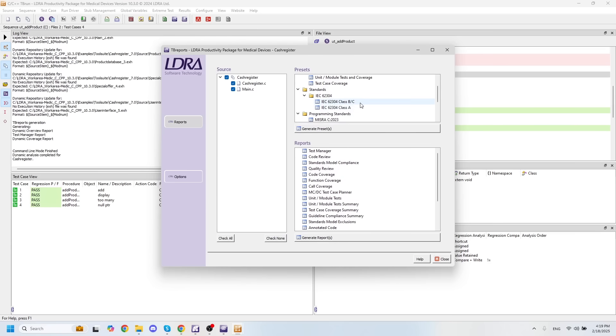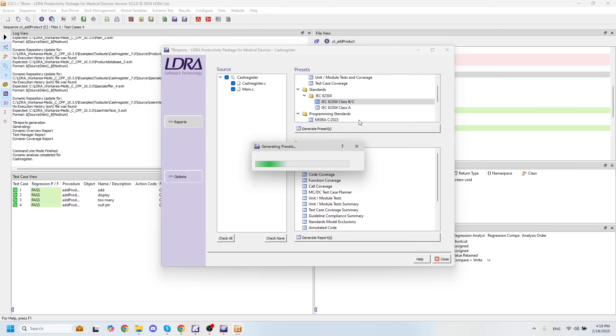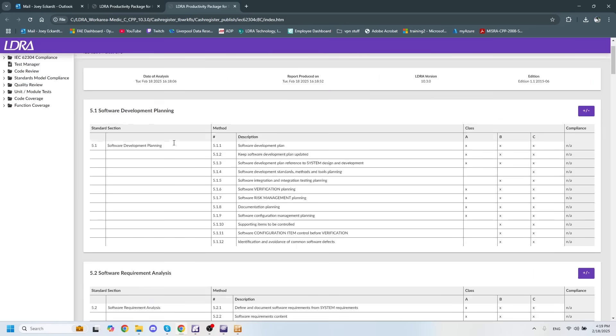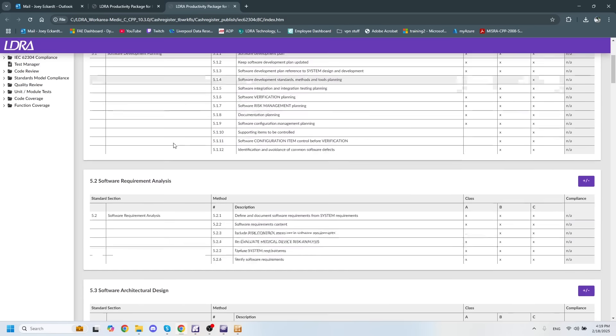If I open up the report for the IEC 62304 classes B and C, we can see that it gives us a bunch of different information that will help us gain compliance with this standard. First of all, we have our software development planning section.